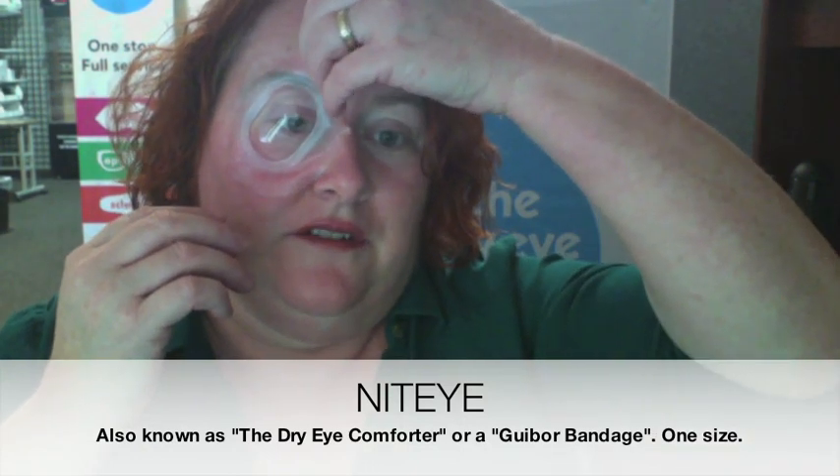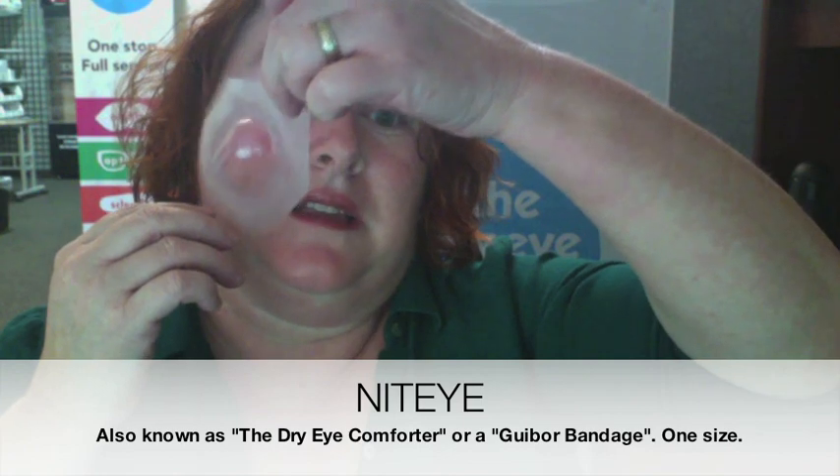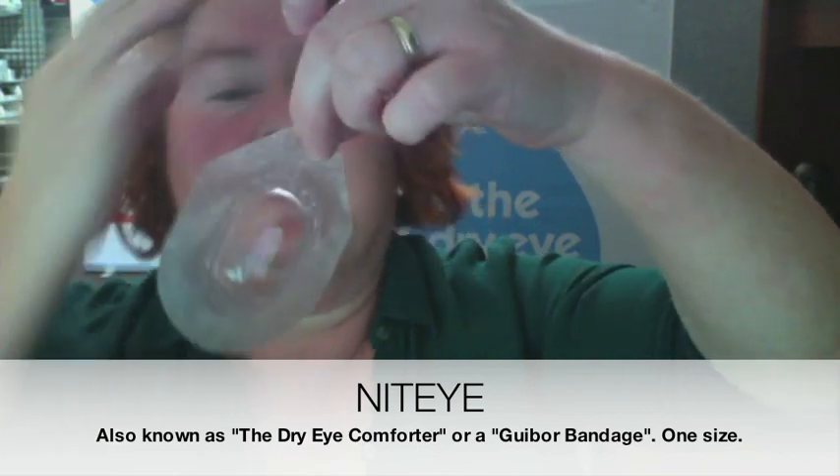And then coming off. The first time taking it off was just about like this — it's not that bad. It sticks down a little bit more on the cheek than elsewhere.